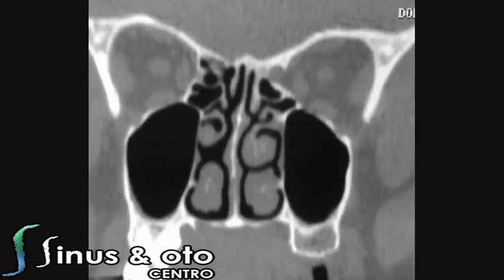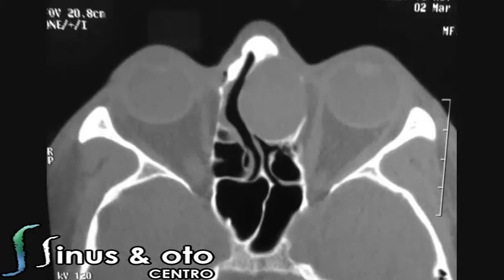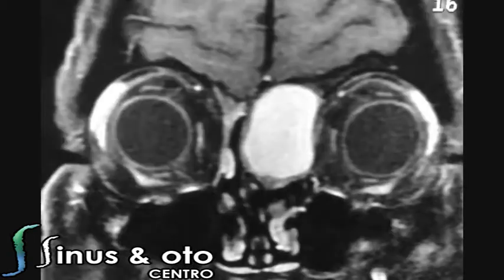We'll see in the MRI in a bit that there is no defect on the skull base. These are the axial cuts showing the lesion in the left side nasal cavity in very intimate contact with the left side orbit content.